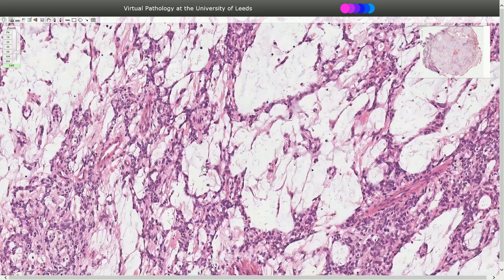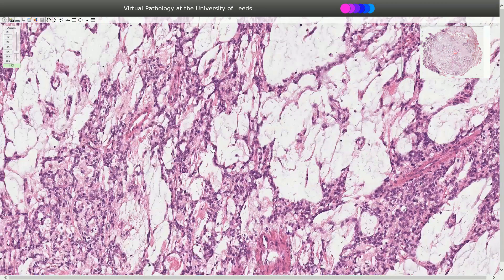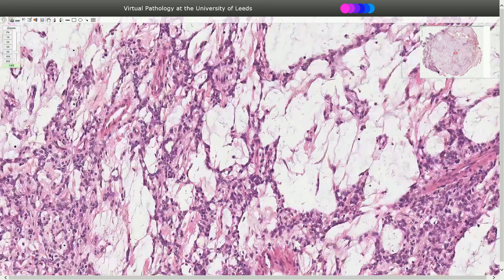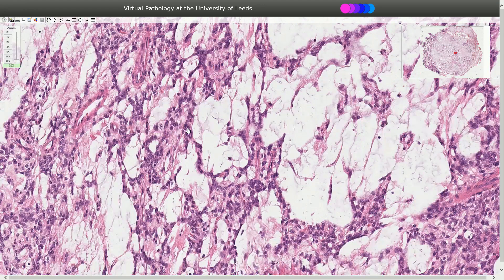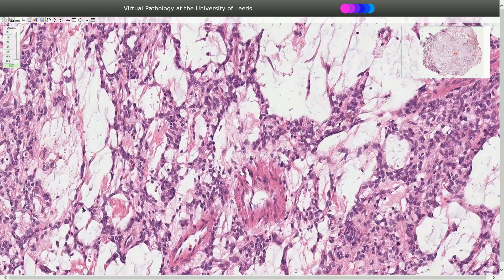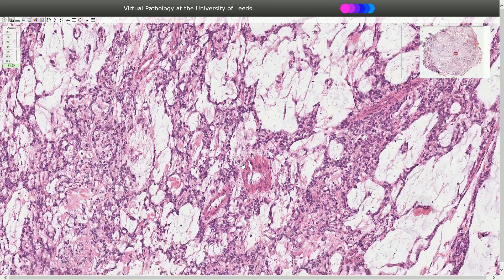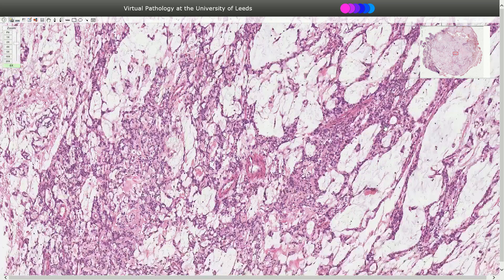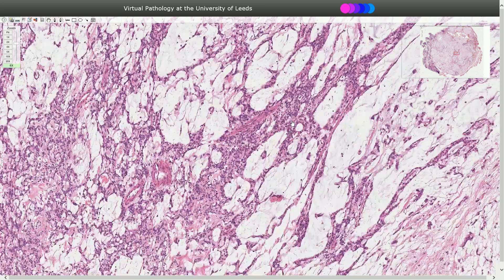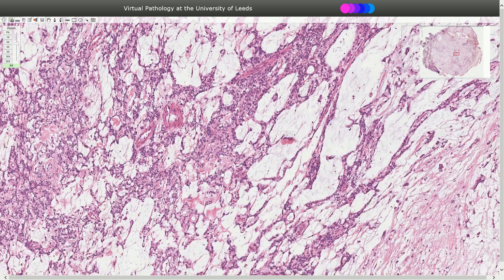On higher magnification we see the classic structure, which is trabeculae or strands of epithelial cells with oval-shaped nuclei. Some of them sometimes look like plasma cells. Also very common is to see duct-like structures or glandular structures, as we can see here.